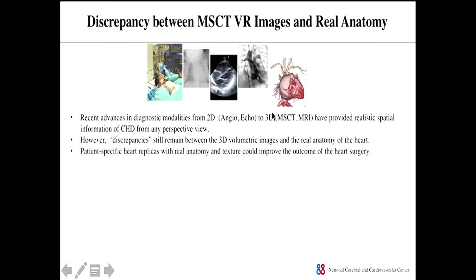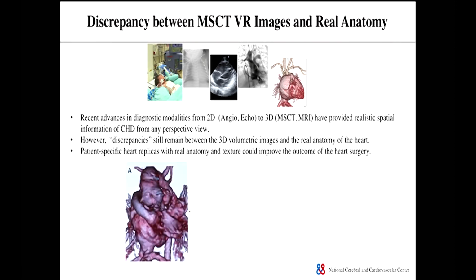If we make patient-specific heart replicas with real anatomy and texture, it should be able to improve the outcome of heart surgery. I'll show you some examples.